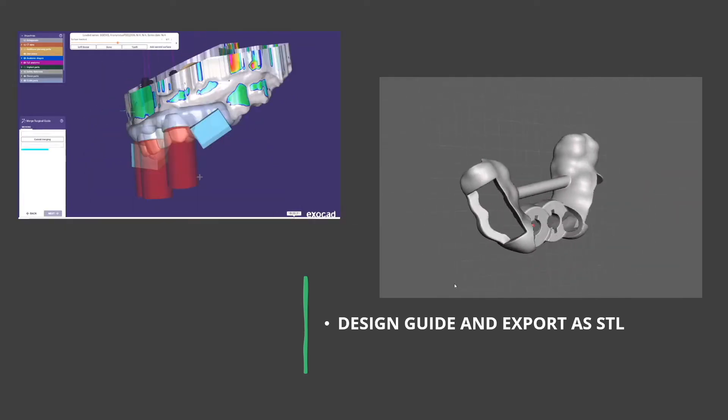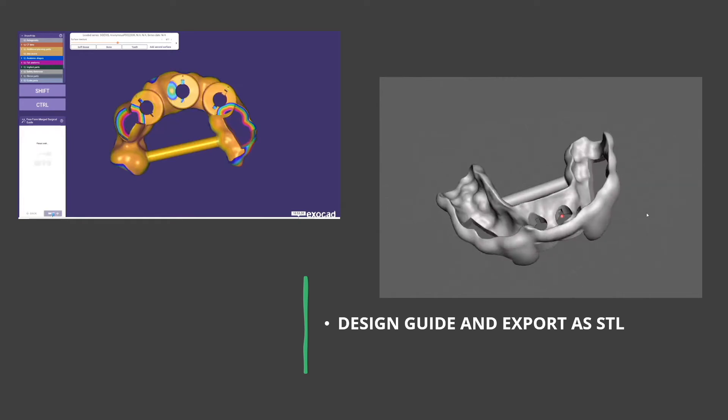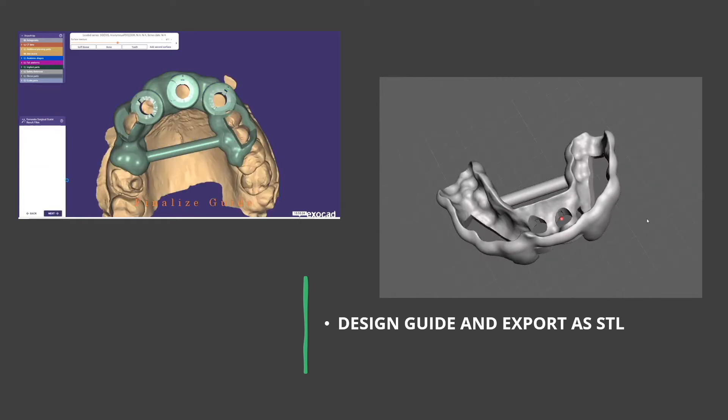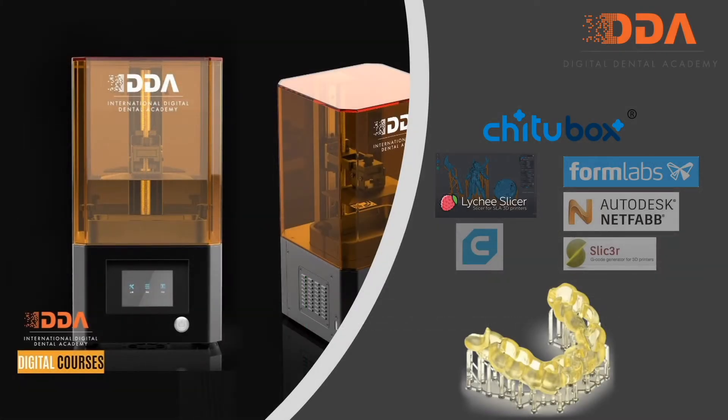We commence the design of our surgical guide in a guide designer software — in this case ExoCAD's ExoPlan — and export the STL as a 3D object once the designed guide has been created. Our 3D object then has to be created using a 3D printer, and each printer will have a unique software to allow us to import this design or STL 3D surface or object into our software to facilitate the production of the design.